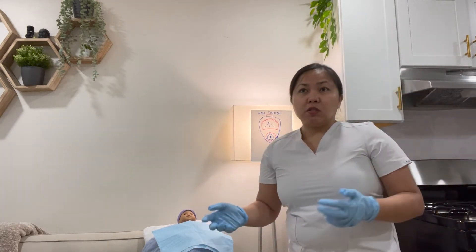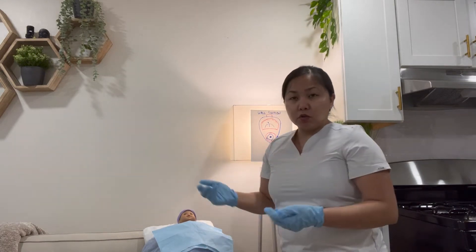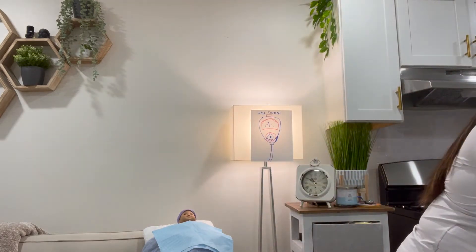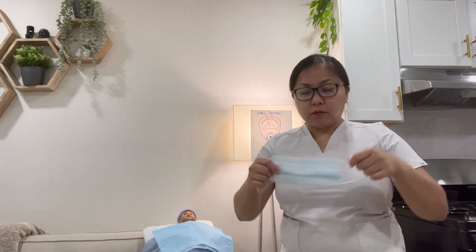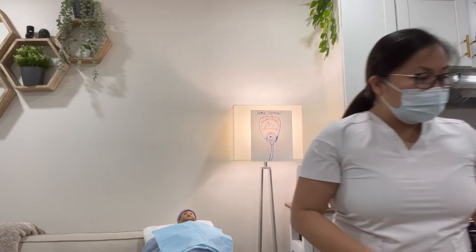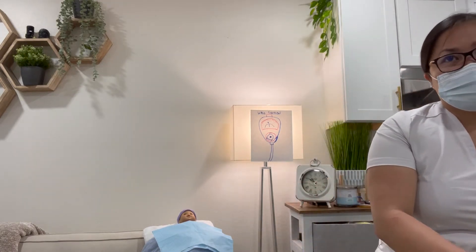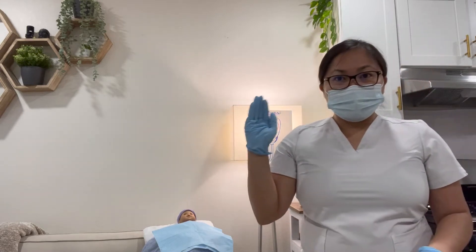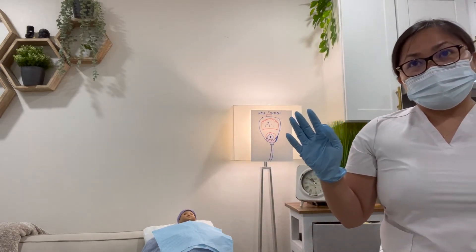Check the patient's oxygen supplement to have it ready and prevent hypoxemia. Then place your face shield or goggles and mask, and put on your sterile gloves using aseptic technique. Your dominant hand remains sterile while your non-dominant hand is the clean hand.